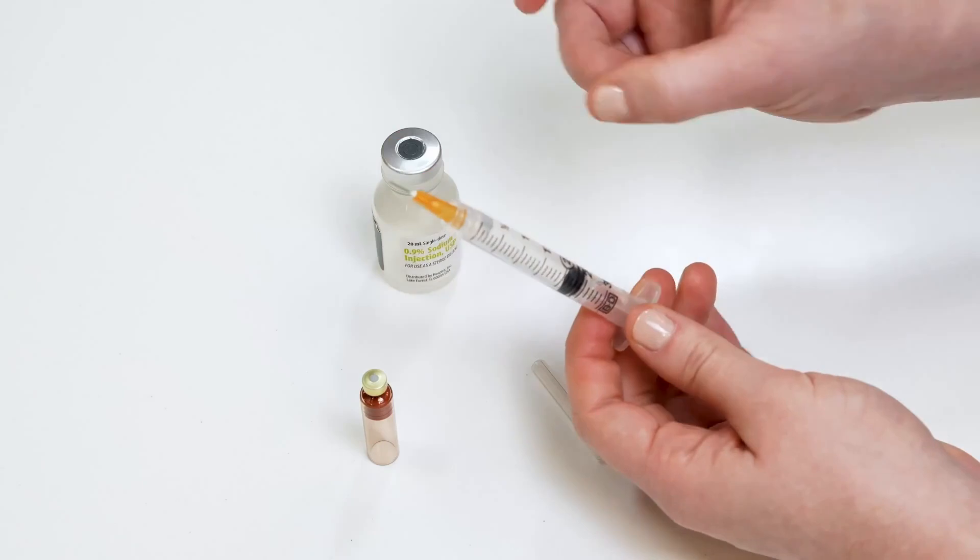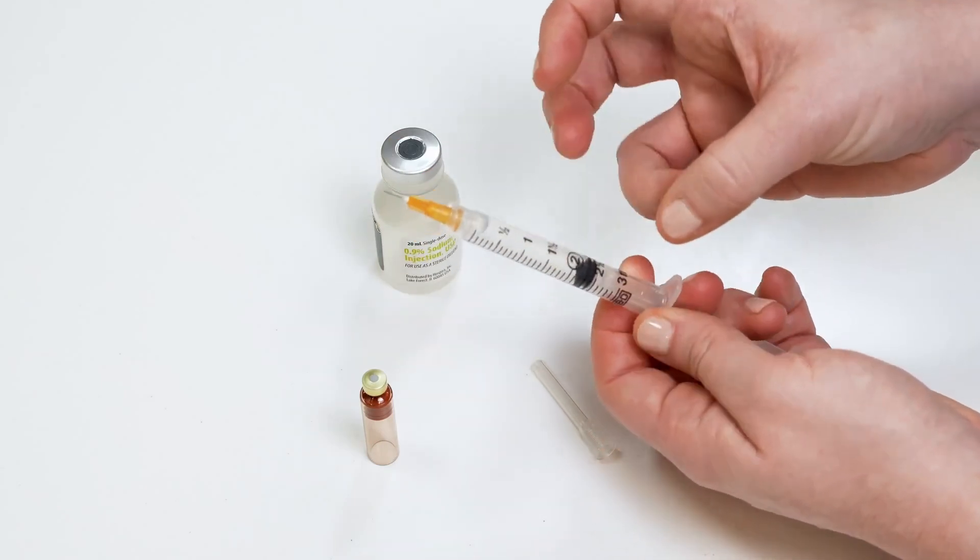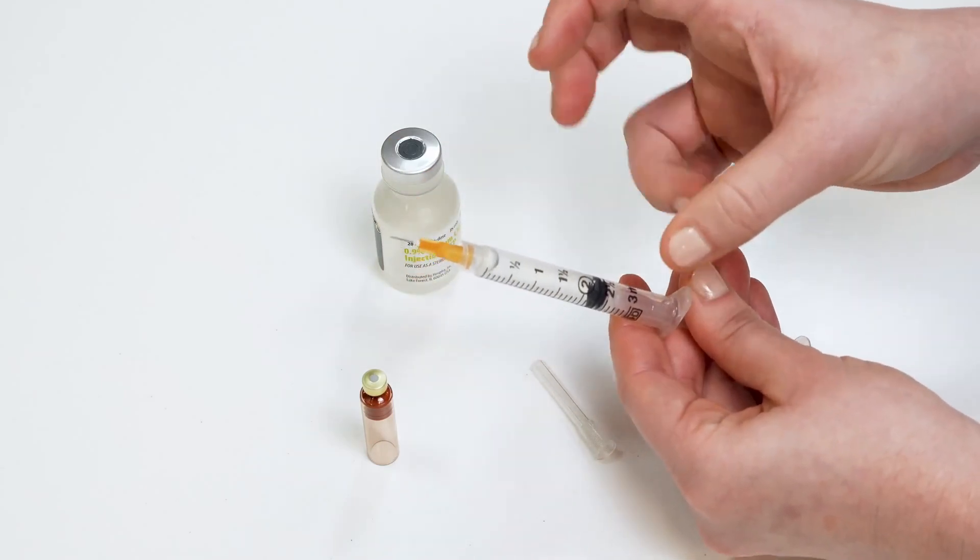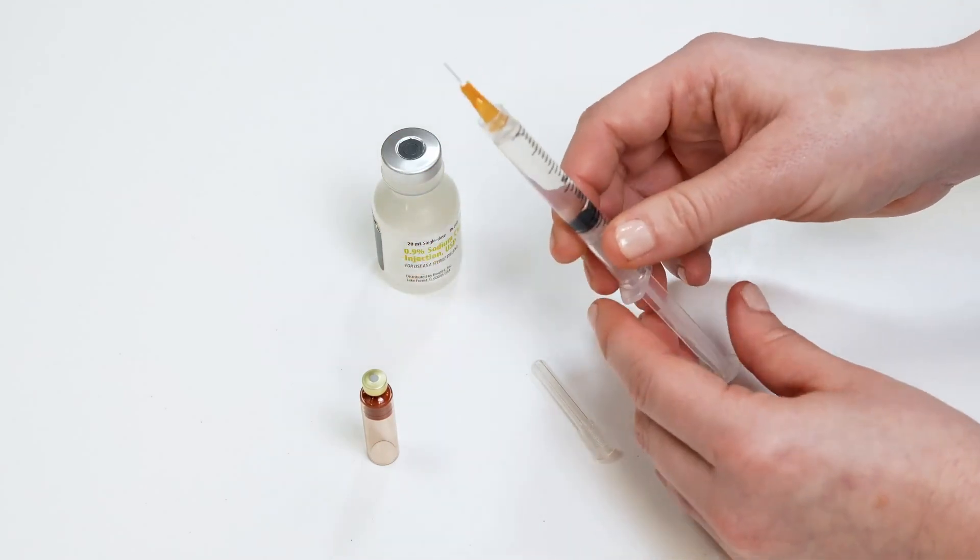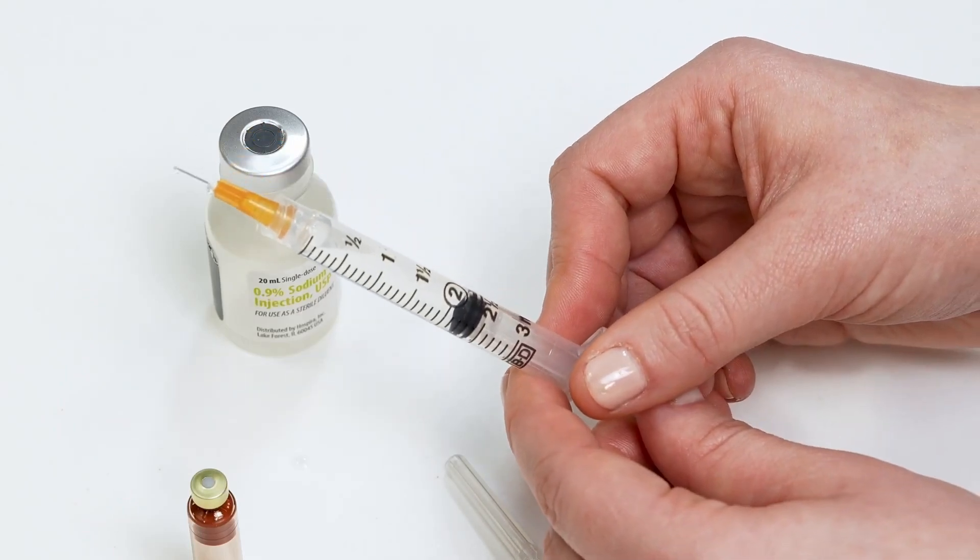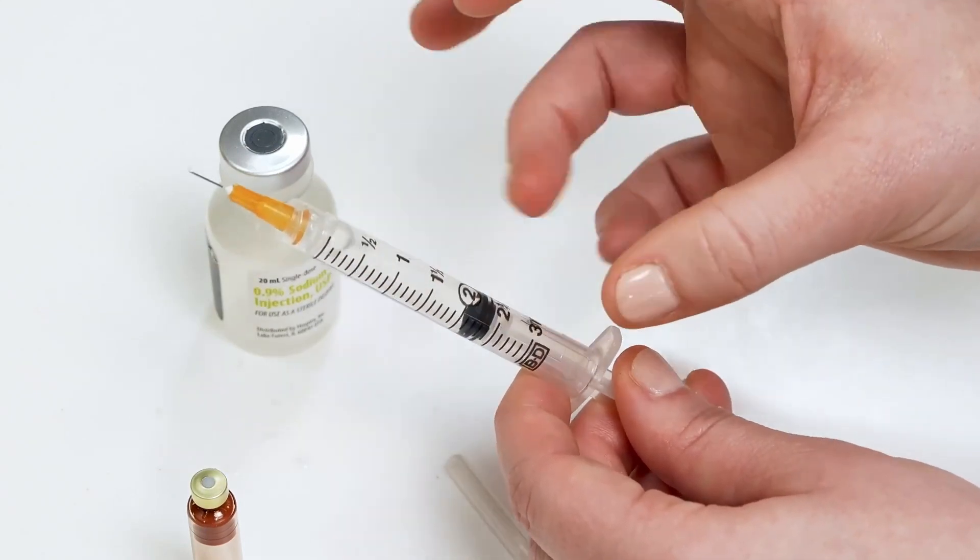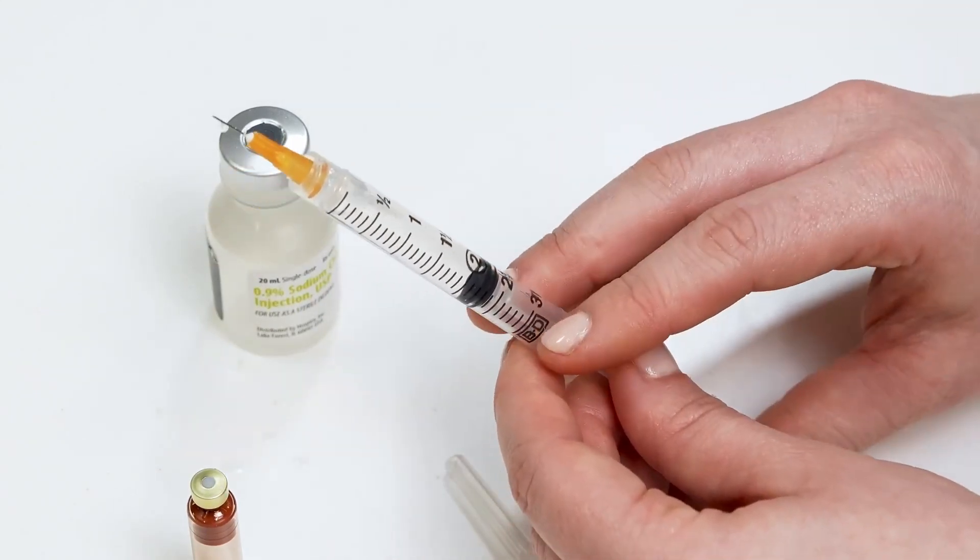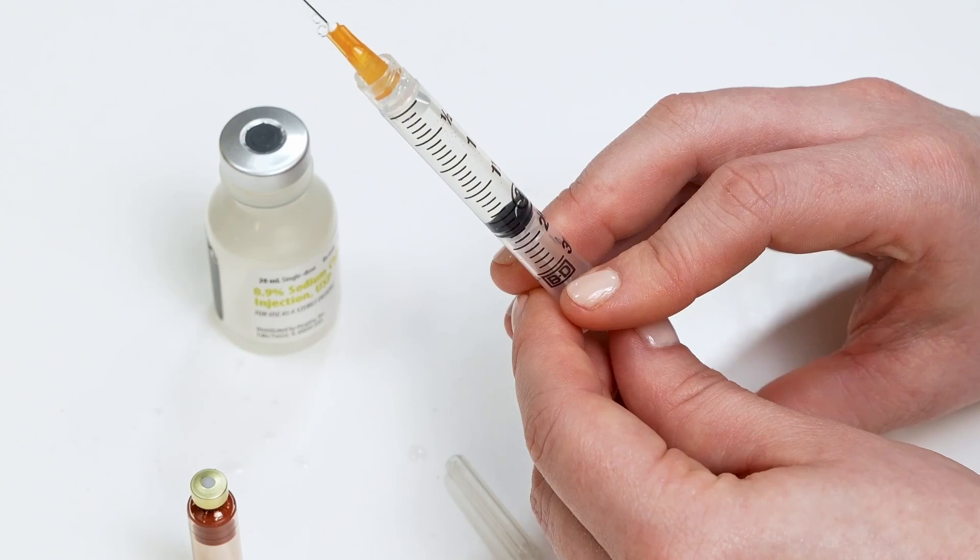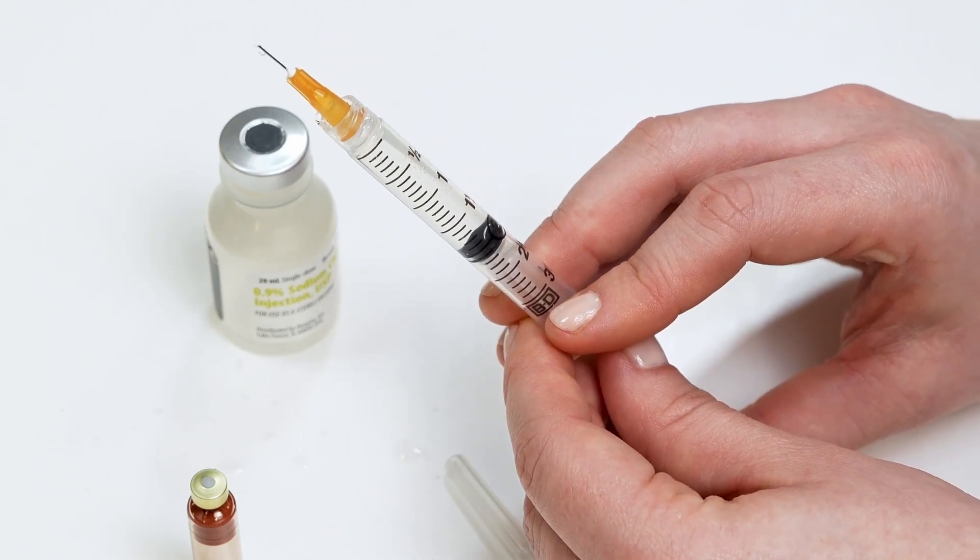Remove any air remaining in the syringe by flicking it with your finger and pushing on the syringe plunger rod to get rid of air bubbles. Pull back again as needed to fill the syringe to about 1.8 ml. When you have removed the bubbles from the syringe, you can now fill the islet cartridge.